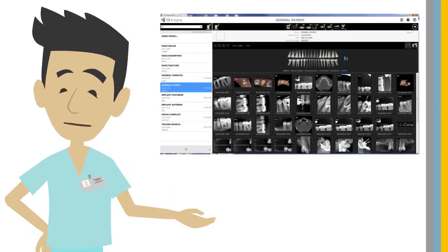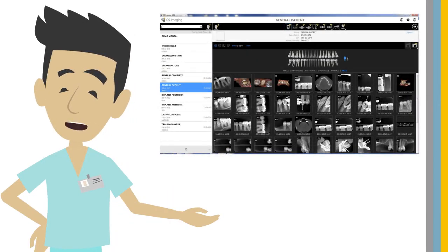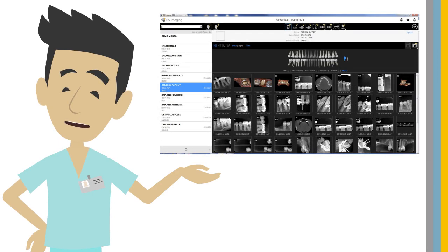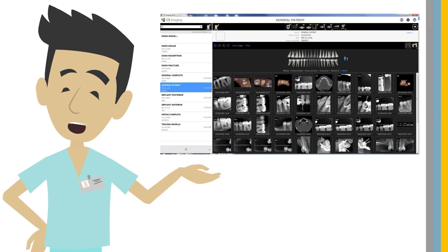CS Imaging Version 8 has a powerful new dashboard image gallery and is compatible with all CareStream dental imaging devices and software. The dashboard shows all 2D images, 3D images, and CAD CAM data sets with multiple display and filter modes.